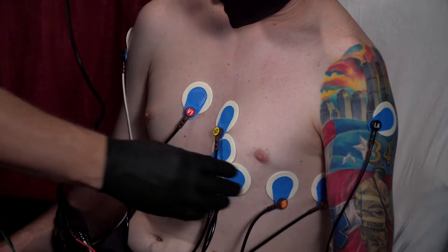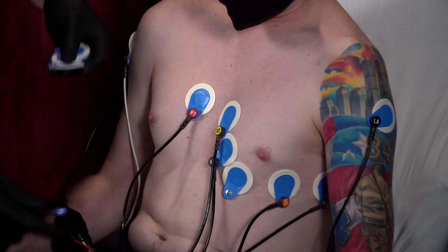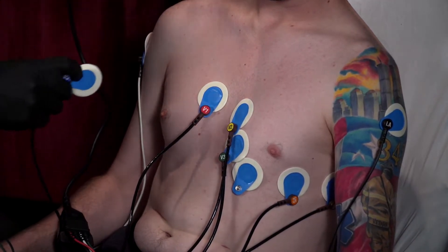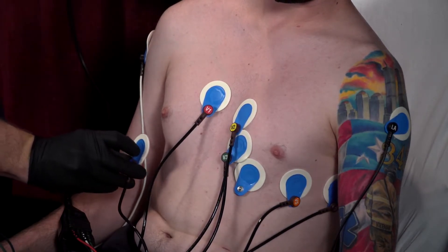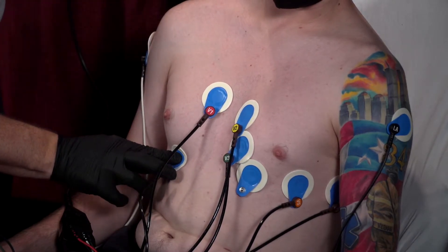Tell our patient we're going to need them to sit forward. We're going to do three things: number one, ask the patient to lean forward; then disconnect several different leads. We're going to disconnect V4 and move it to the same margin on the right side — in the fifth intercostal space, midclavicular, on the right. This is called V4R.